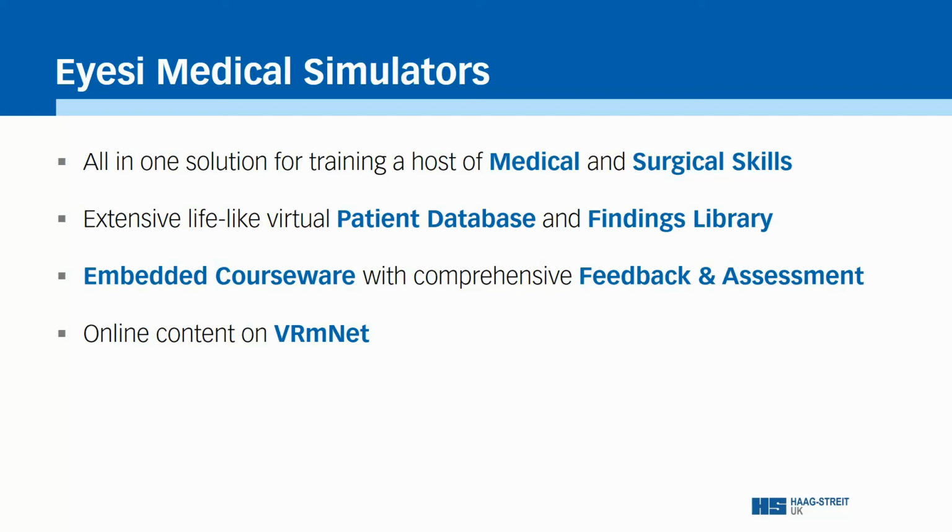This embedded simulator content is augmented by additional online medical content via the VRMNet portal, and a fully networked solution allows learners to continue their progress on any linked simulator, PC, or mobile device.